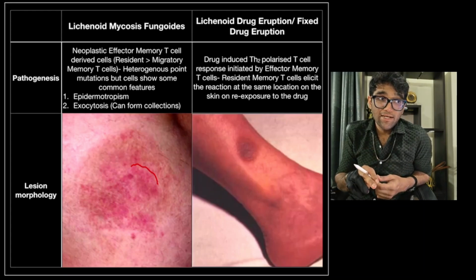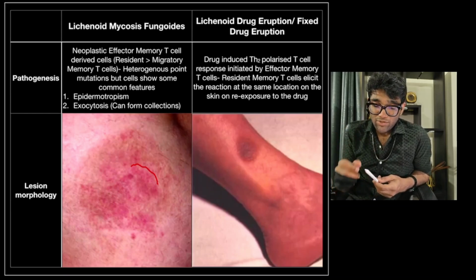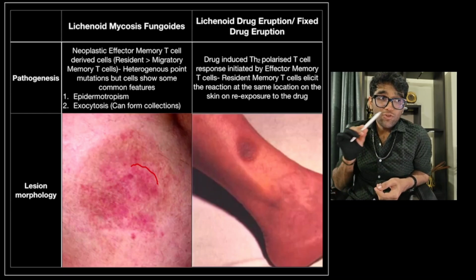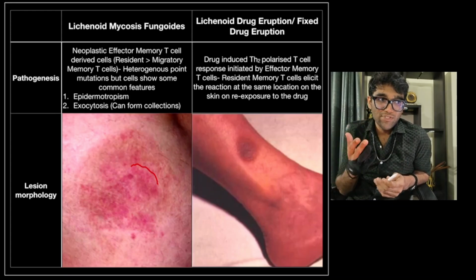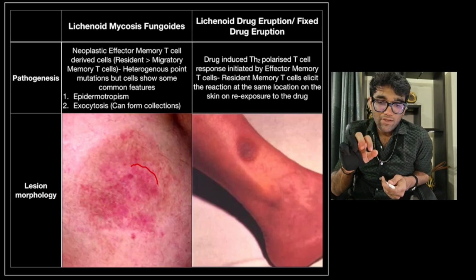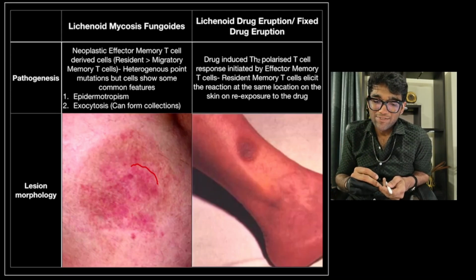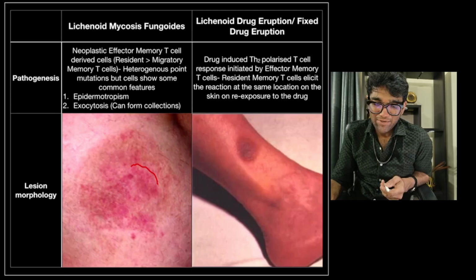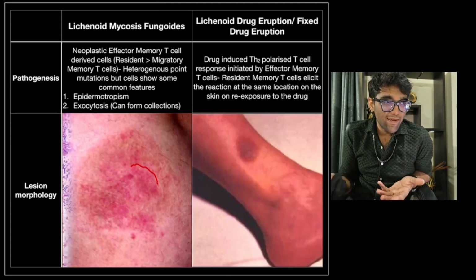Now what that means is that those dermoepidermal holes that were forming, that are characteristic of interface dermatitis, almost all of them are filled with lymphocytes, because obviously it is the neoplastic lymphocytes that are causing the death of the keratinocyte, and therefore you will find the killer right next to the killed keratinocyte. Now histologically this looks as you would expect it to look.